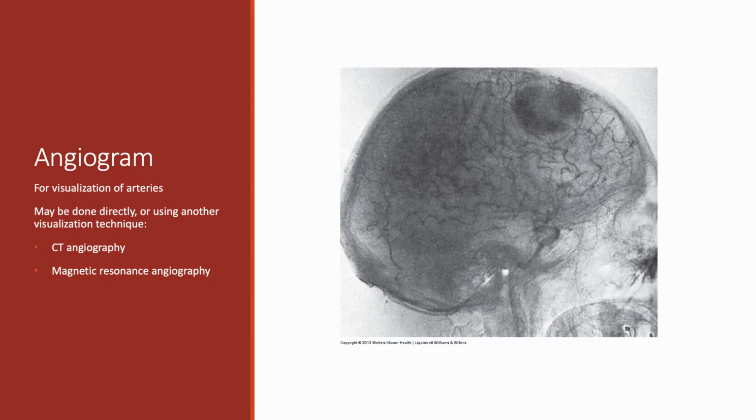Now, the other technique that they use here, because you probably are thinking, when you inject dye, I've seen that be white. Well, they do this thing called digital subtraction angiography, or DSA, where they just put up the opposite images.